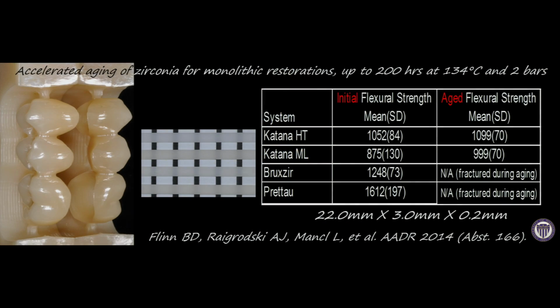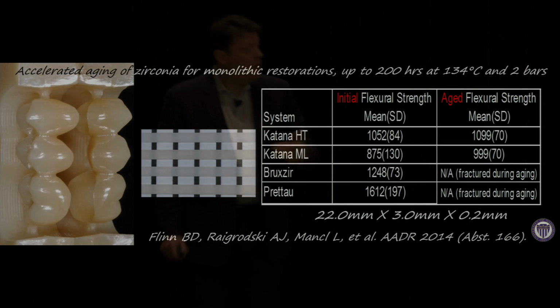And the other 2, after 100 hours of aging, fractured spontaneously. So I'm not saying that those 2 brands are going to fail intraorally. These are extreme conditions. But in general, I want to know what the values are, and maybe I would go with a material that provides higher values over time.